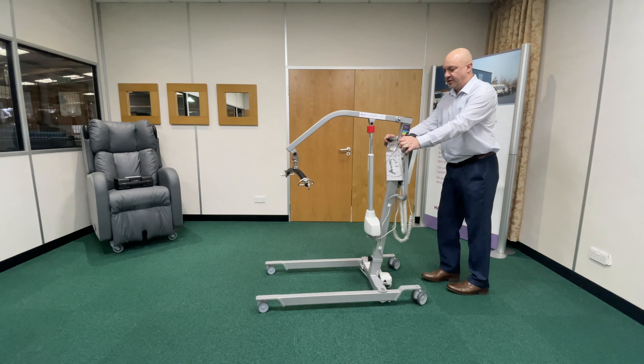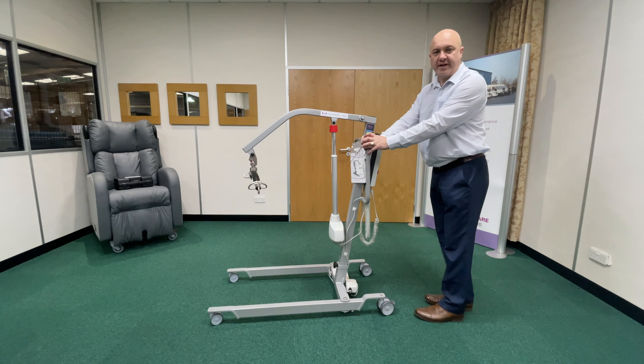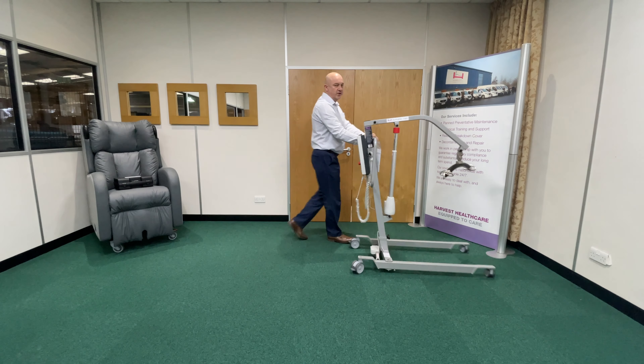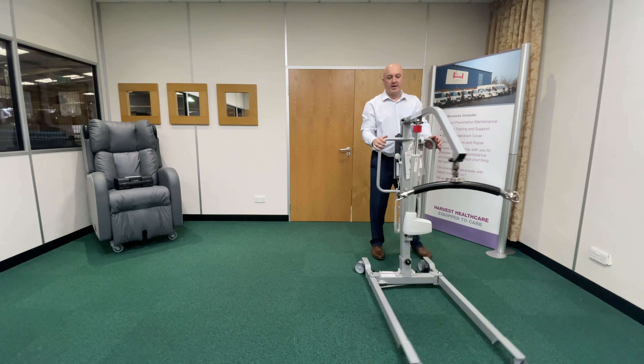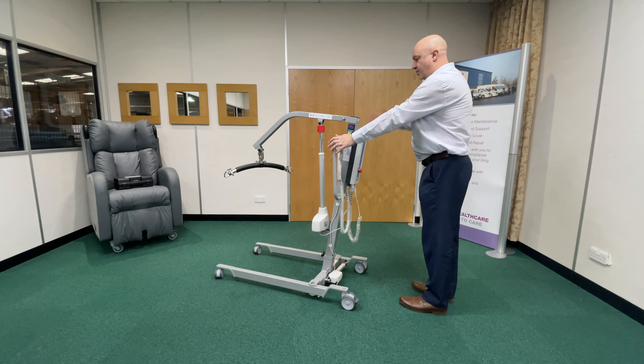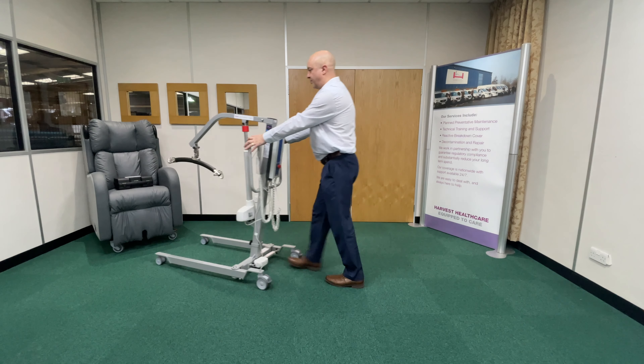If I want to turn to the right, bring the hoist towards you — if I turn to the right, right handbrake, push the left-hand side, and we can do it round and round in circles. Whenever we get to face the direction we want to be — if it's towards the chair in the corner — I then take the brake off and go towards the chair.